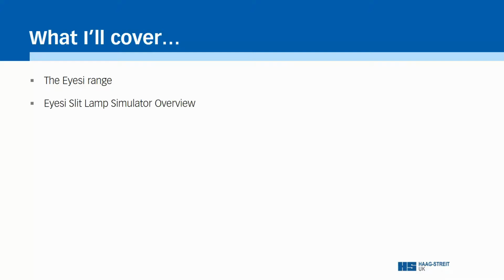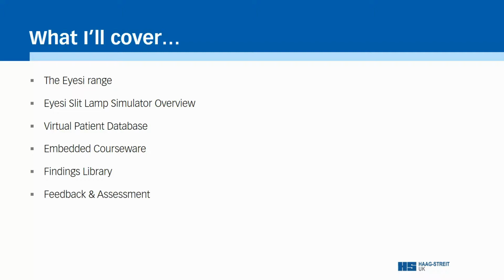I'll then focus on the features of the Eyesi Slit Lamp simulator, including the virtual patient database, the embedded courseware, the findings library, and the educator feedback and assessment function. I'll then introduce VRMNet, Eyesi's online learning facility, also available with the surgical simulator, followed by a virtual demonstration of the Slit Lamp simulator.